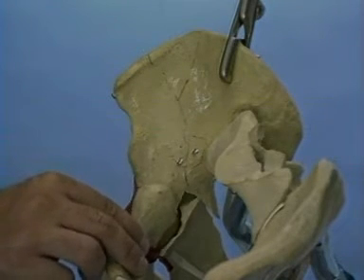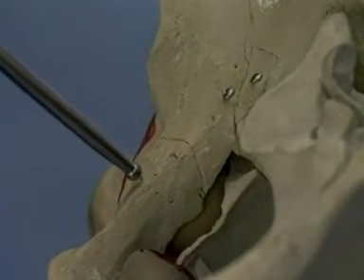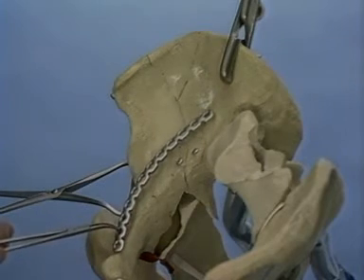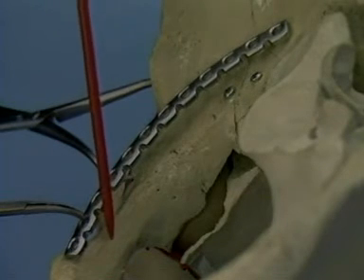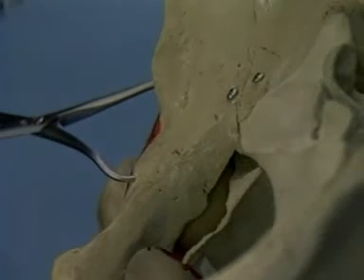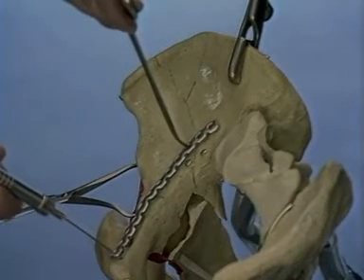The lower portion of the anterior column is reduced by pressure from the ball spike, and the reduction is held with a pointed clamp. A 12-hole plate is seen to be the correct length for fixation from the internal iliac fossa to the superior pubic ramus. It may be necessary to adjust the curve of the plate to match the individual pelvis. The plate is concave over the superior pubic ramus, convex over the pectineal eminence, and then again bent in a concave fashion over the internal iliac fossa. A 2.5mm hole is drilled through the distal plate hole for insertion of the 3.5mm screw. The depth is measured and the screw is inserted, but not fully tightened.